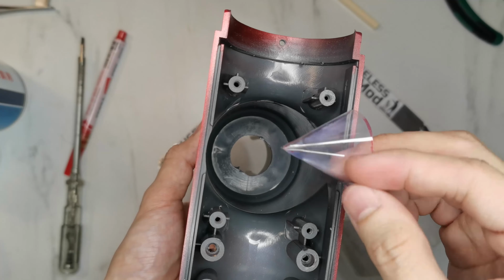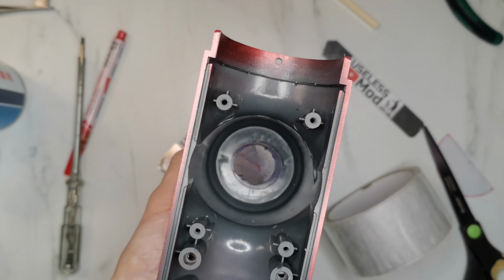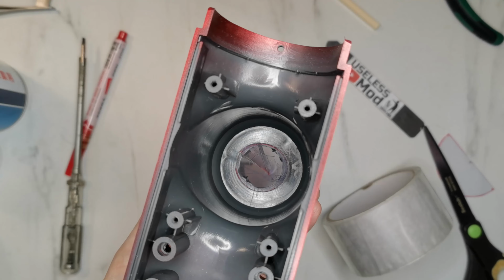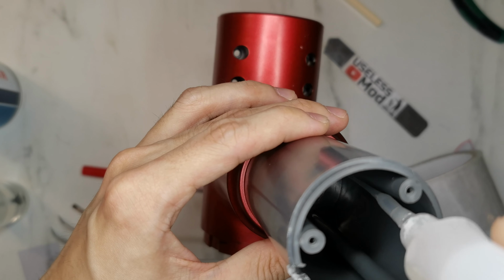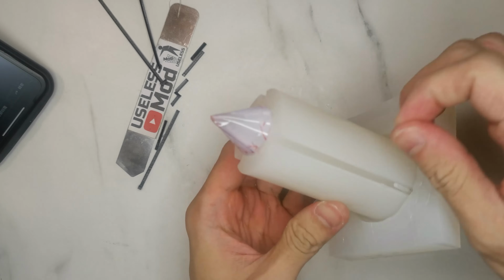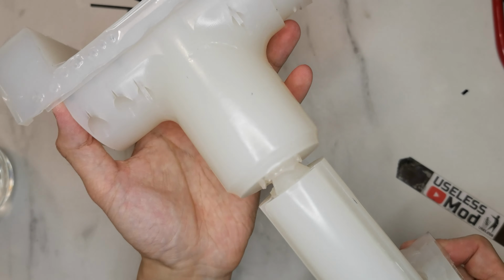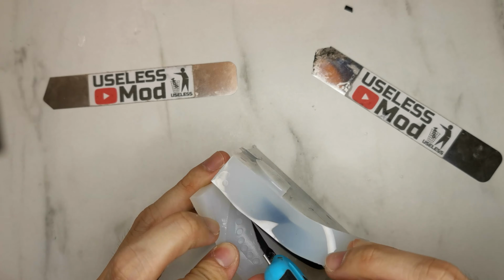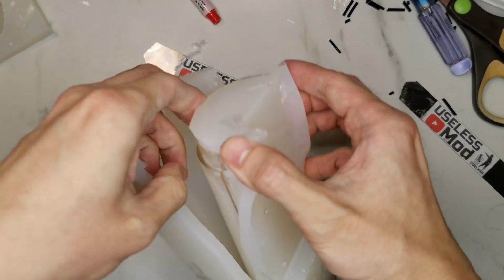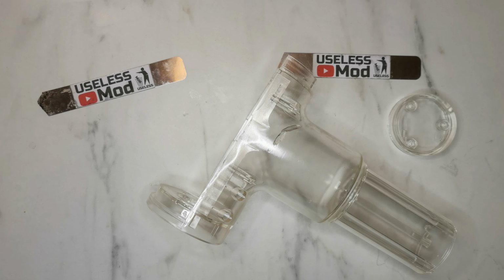This time the mold is a bit special compared to my past video. Due to the special shape, I need to add a cone inside the mold so I can separate those two parts. The final mold looks like this, so the two molds can fit together inside another part of the mold. After all the mold making and clear case casting, all the cases are finished.